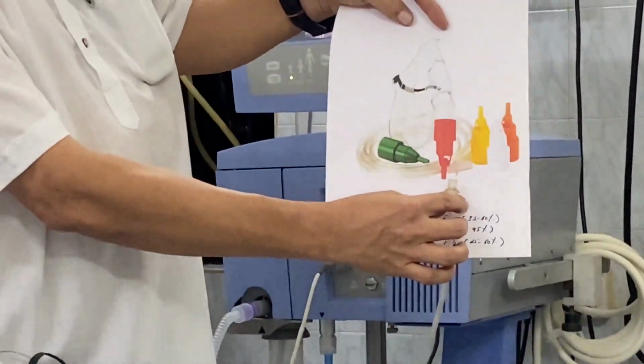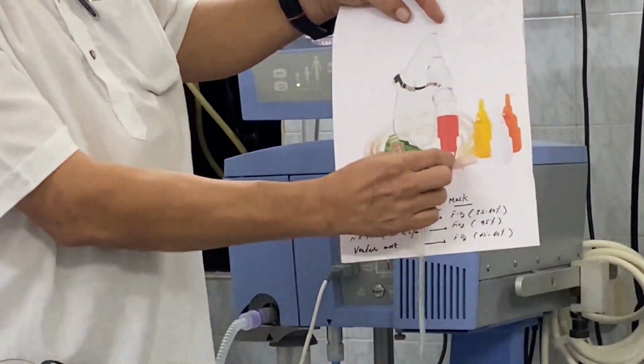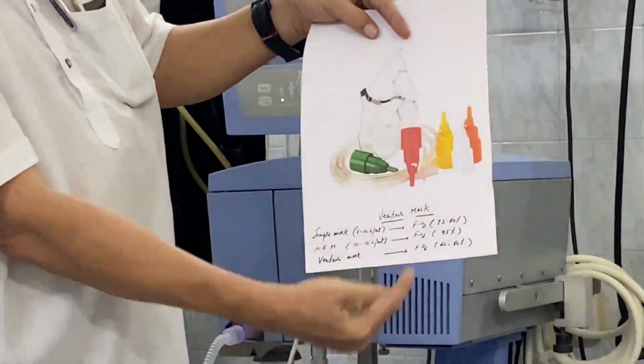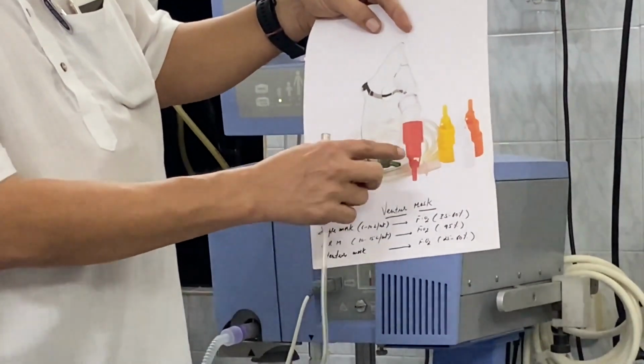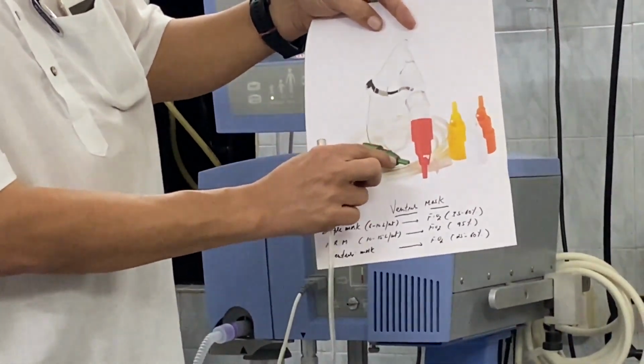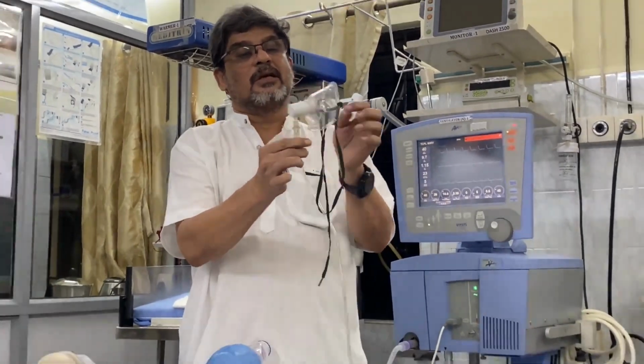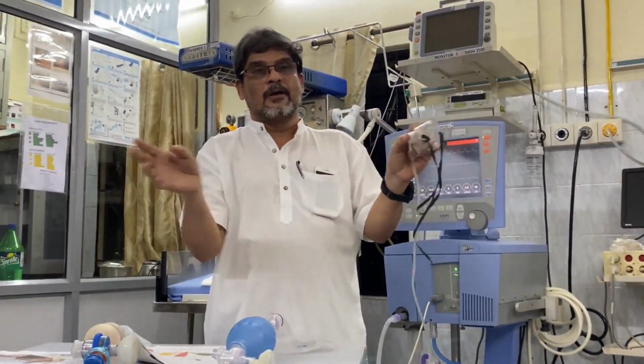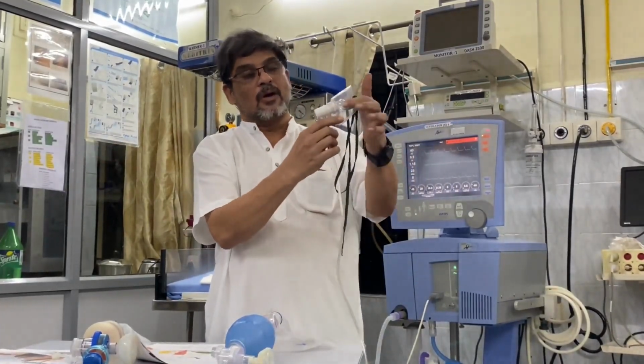What Venturi does is, when there is high flow oxygen going through a narrow caliber, you can change the diameter of these inlets. So it creates a high pressure jet, and there are side holes to this adapter. It has got holes all around.